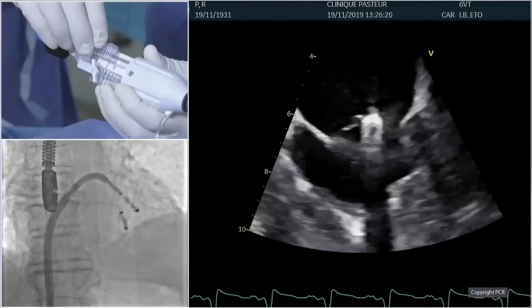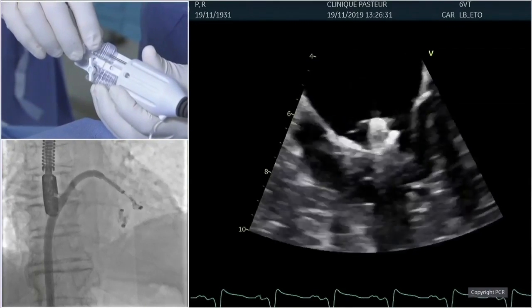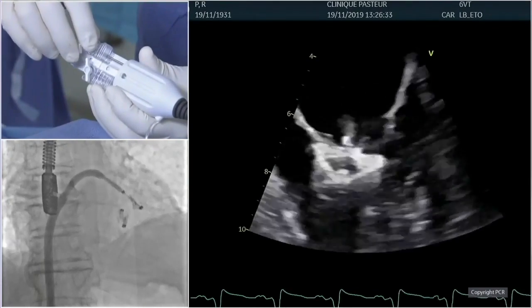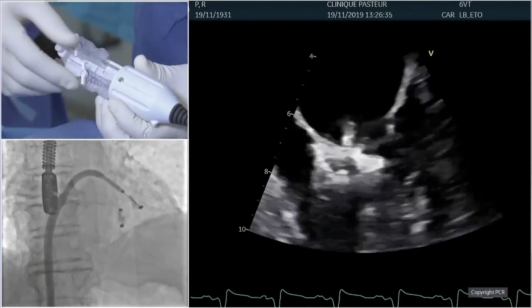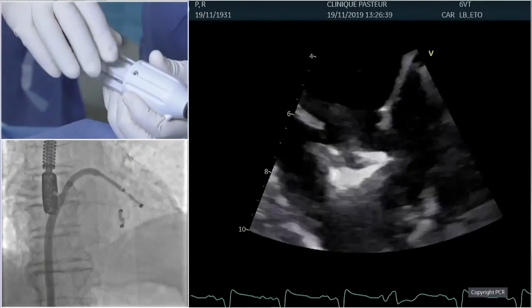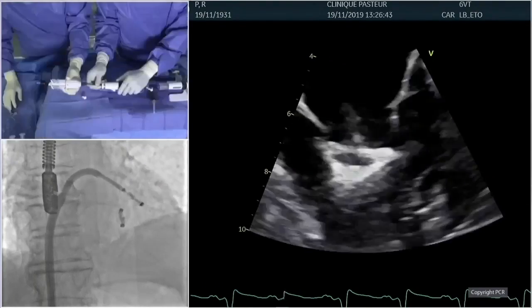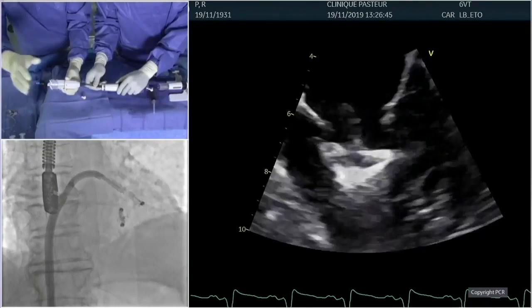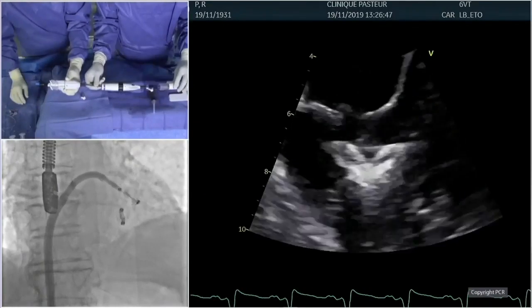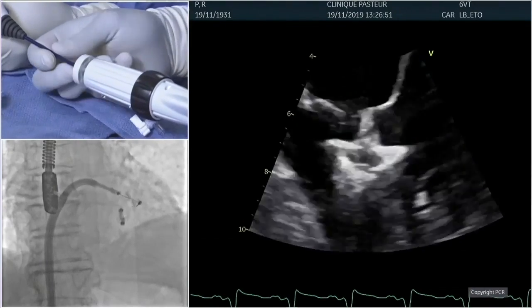No, I'm not sure, but you see where the leaflet is. We are a little bit far. Okay, so let's lift both clasps, and we're going to repeat again. We need to correct the trajectory a little bit, because we are not really perpendicular. So let's not flex that much. And we are a little bit far now from the implant. You see, the second one. So let's move back a little bit.